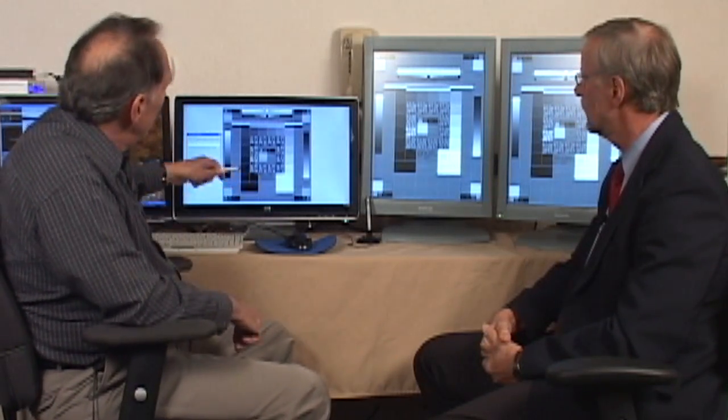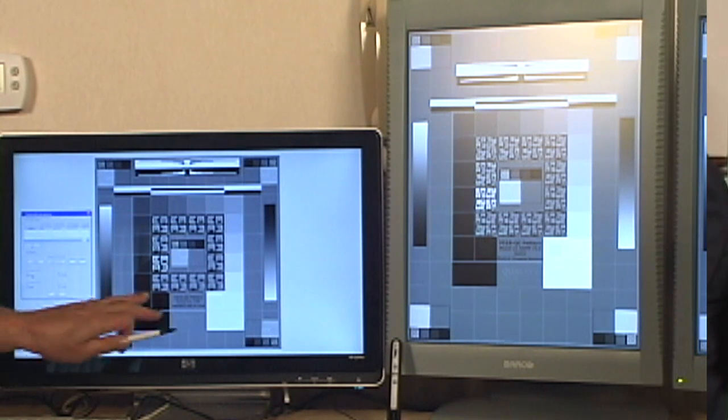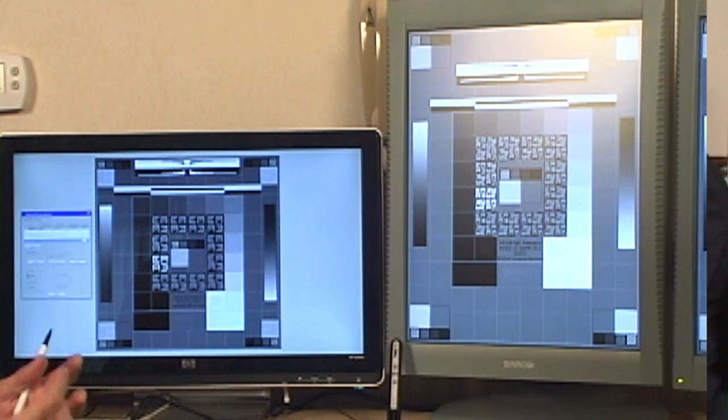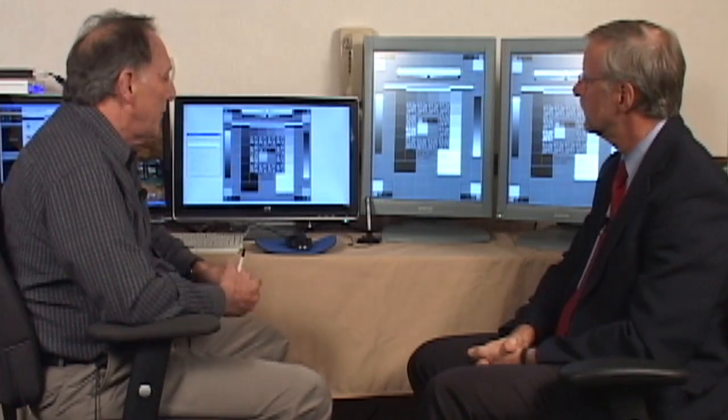The thing that happens in commercial displays, which are not actually calibrated the way medical displays are, and that's one of the key differences. Medical displays all follow a log linear function in terms of their output in response to the digital driving levels. Commercial displays, on the other hand, are very different. They're meant for office environments, so a lot of times they're very strong at the top end. They're very bright for a bright office environment, but they're very poor at the low end. So they're not calibrated correctly.